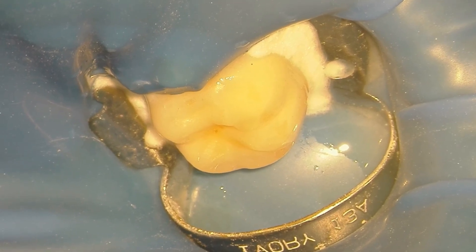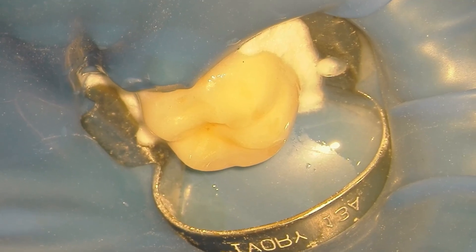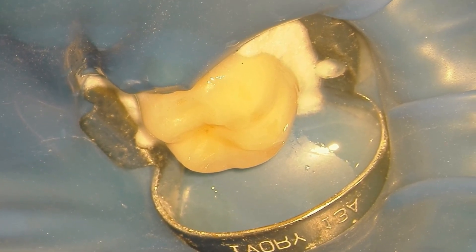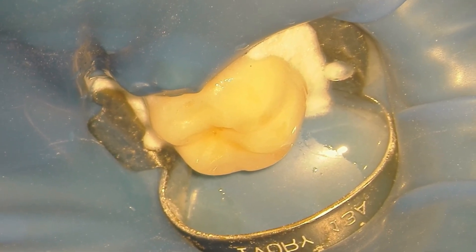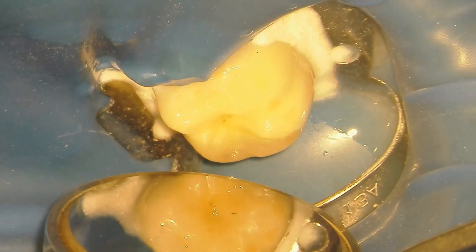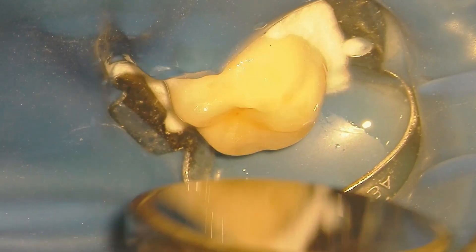In this video we're going to discuss the easy method of placing a split dam for a tooth in preparation for root canal therapy. You'll notice that the dam is already in place, but this is a setup for why and how we're placing it. This tooth is prepared — tooth number 30 — for root canal therapy.